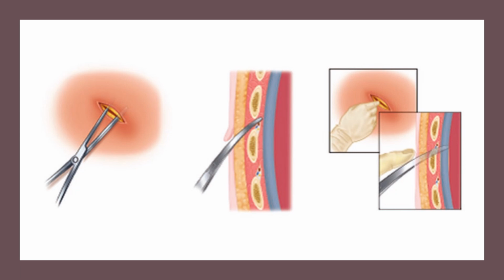7. Guiding the closed Kelly clamp over the upper margin of the rib, enter the chest wall. This will require some controlled force and a twisting motion. Once the pleural space is entered, a rush of air or fluid should occur. Uncontrolled force and a lunging motion can result in penetration to the lung, heart, liver, or spleen.